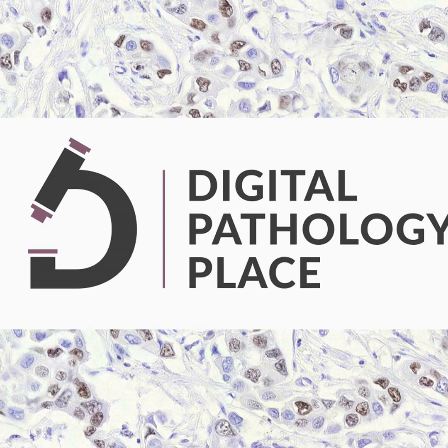So it's not deep learning, but it's an example of the same principle. When I used to work in the classical computer vision space for a tissue image analysis company, I was on the other side from where you are now. I was the pathologist working with computer scientists and image analysis scientists. And there was this push for always having to segment cells for quantifying IHC, where many times it would deliver the same information, usually some percentage of area stained, if you would just analyze pixels. But somehow it was regarded as too basic, and then you would have to run into all those problems in cell segmentations when the cells didn't match what the cells look like on the tissue.